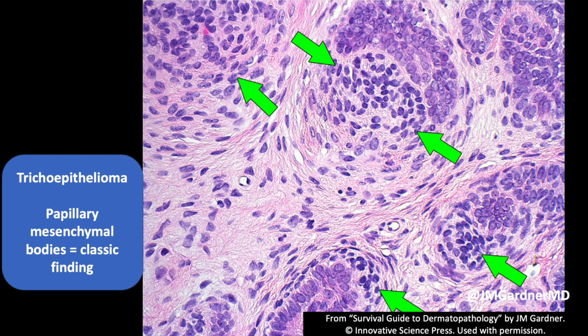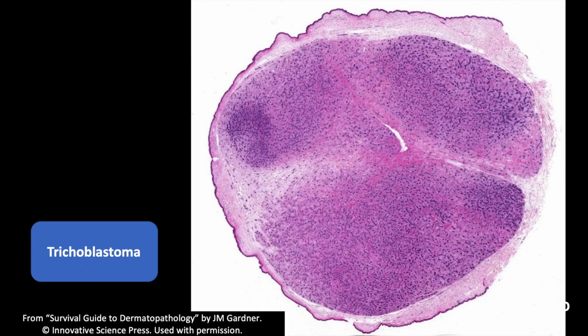There have been a lot of other stains people have proposed, and to me, I've never been convinced by any of those enough that I felt it would overrule what I saw morphologically. But I do find CK20 helpful in select circumstances, and again, we talk more about that in that paper at the beginning.